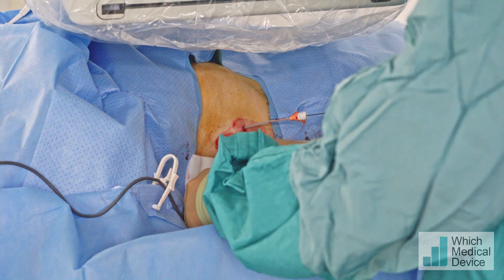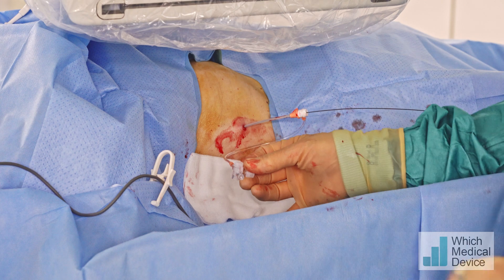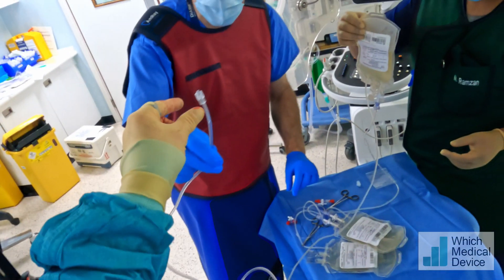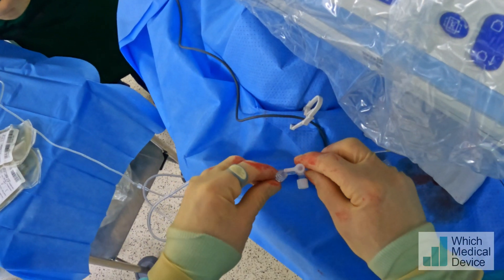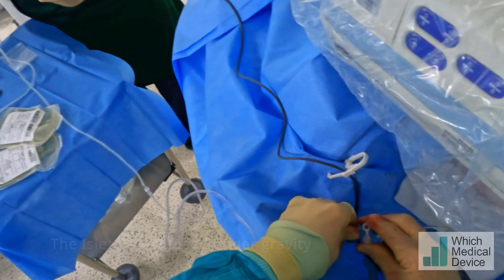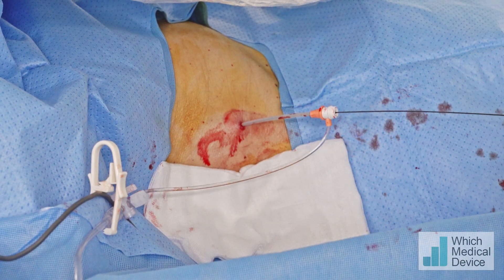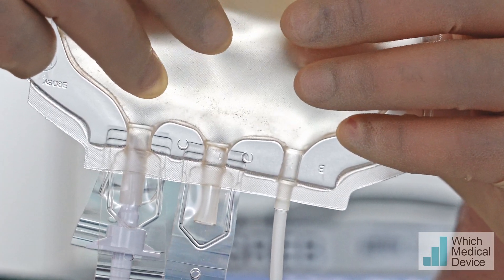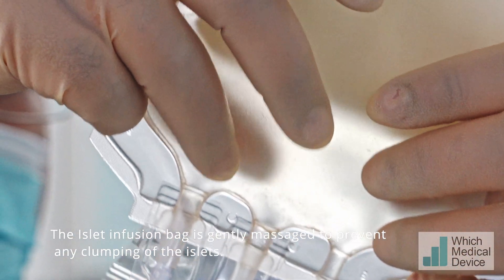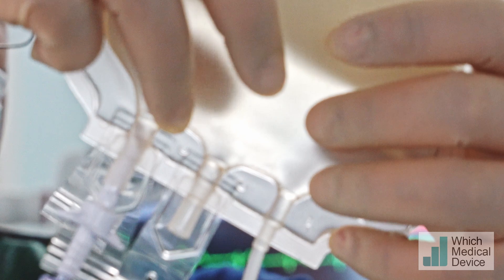We're now going to close that again and disconnect without moving the pressure sensor to a different level. We're ready for the infusion of the islet cells. We've got bubbles coming out — I just want to get rid of that air bubble. We're open now. We're infusing the islets in a steady flow using a wide-bore tube connected up to the infusion site. We want to ensure that we're not having clumping in the ports, so we're keeping the islets moving and infusing under gravity. It's nice to see that a transplant surgeon still has a role in this procedure.